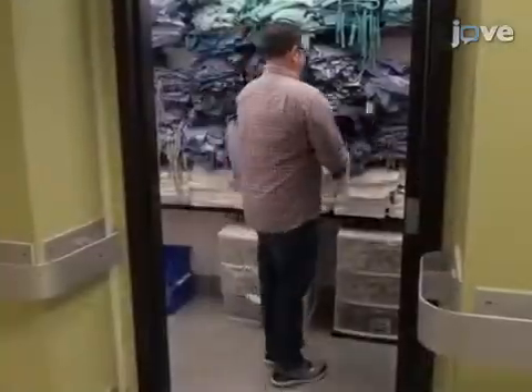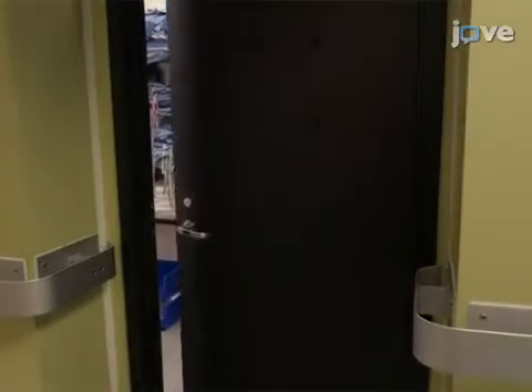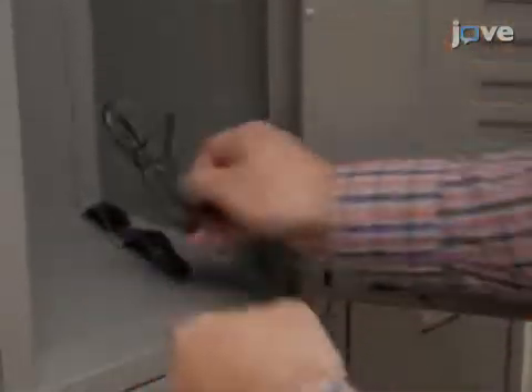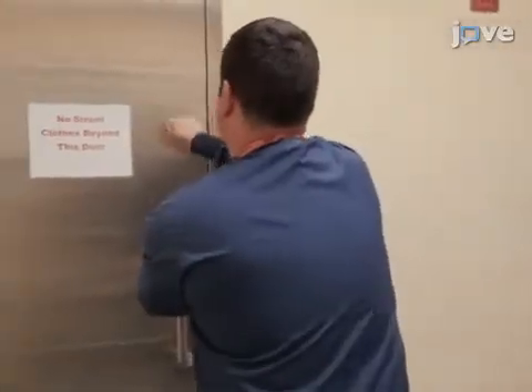Obtain scrubs, socks, and towels from the storage room containing the facility's supplies located near the personnel entry-exit logbook. After passing through the security access control points to the outer change room, remove street clothing, undergarments, jewelry, and watches. Don scrubs and proceed to the suit room.